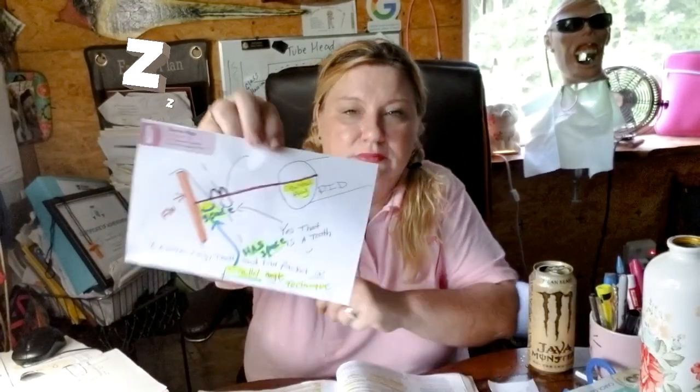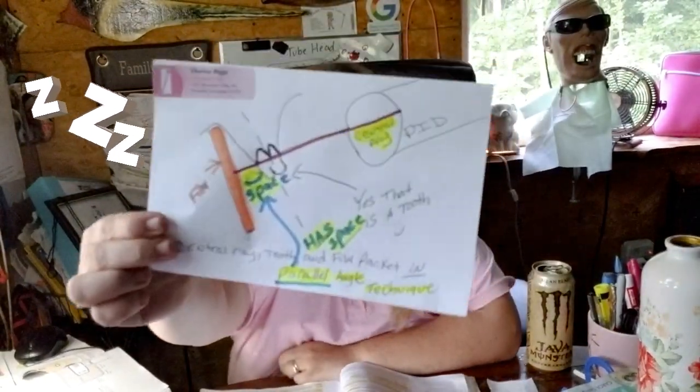Now, I want to talk about something else. Central ray and bisecting angle technique. Parallel angle technique and bisecting angle technique. People get these confused, so I'm going to tell you guys how to remember it. The central ray in the tooth and film packet is all parallel, but there's a space between the tooth and the film. See right here in yellow? That's the space between the tooth and the film. That's how you know you're doing the parallel angle technique. The bisecting angle technique is where the tooth is actually touching the film.